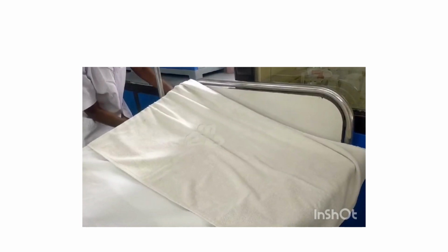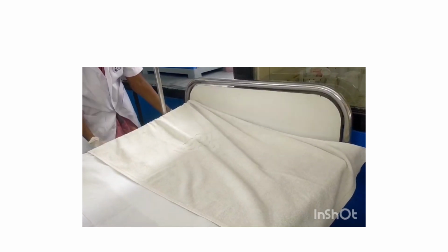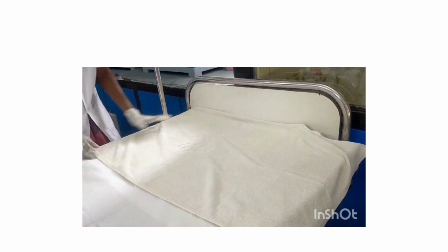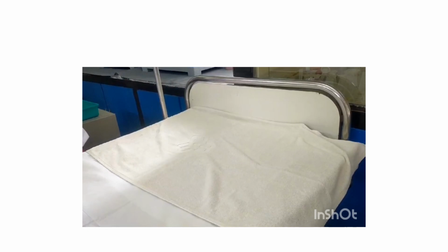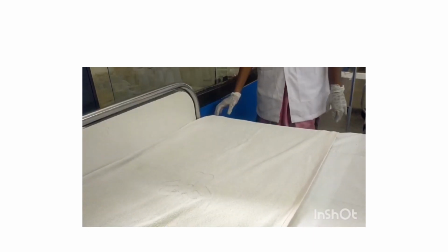On the working side, tuck the sides of the towel, and after completing on the working side, move on to the other side and tuck the other side of the towel. This is the post-op bed.